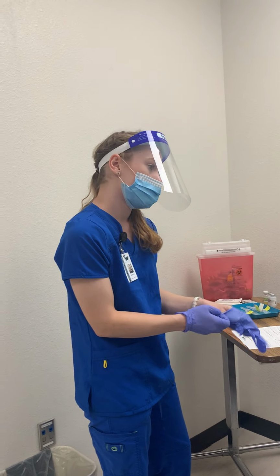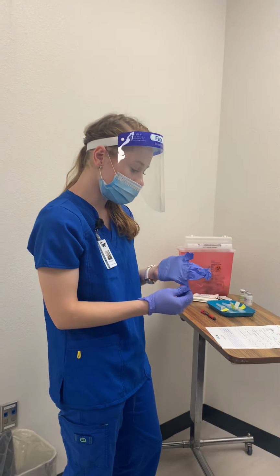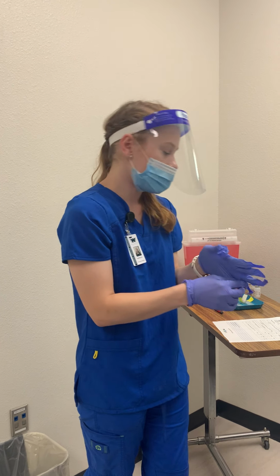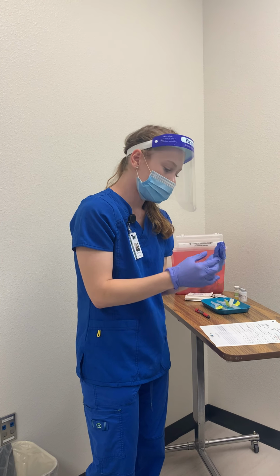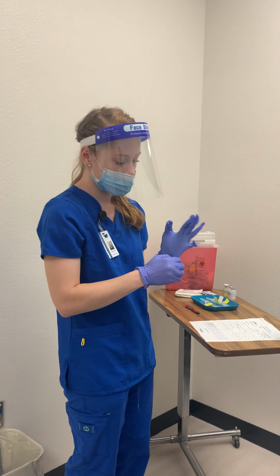What I am going to be administering today is a TB shot. It's just going to go a little bit under your skin. And it's just a test for tuberculosis we do in the hospital a lot of the times. So we'll do that. And then I'll also be doing your Phenergan. Are you still feeling nauseous? Okay, you are. Okay, so I'll get that administered.